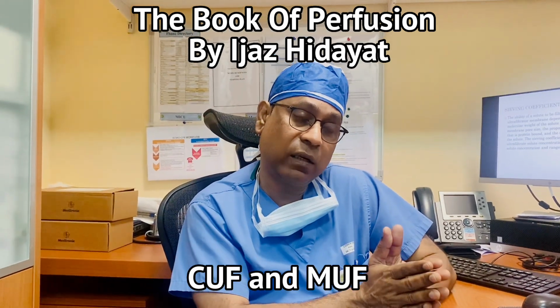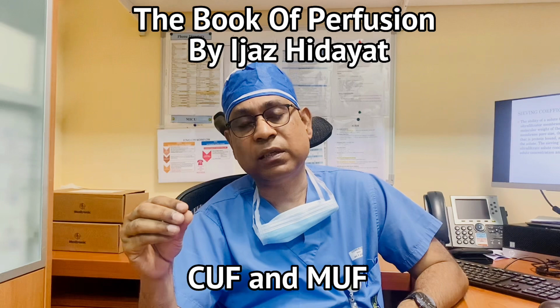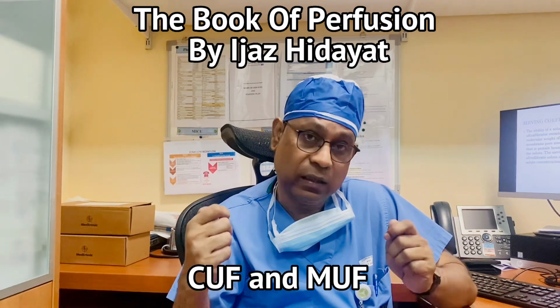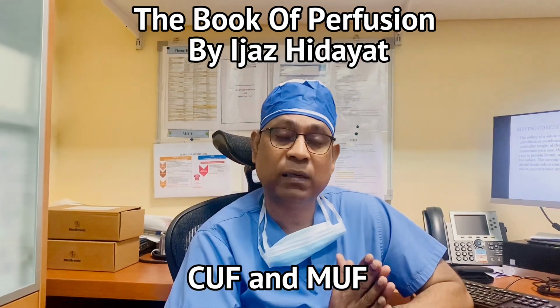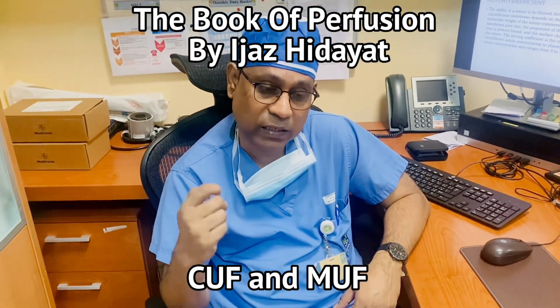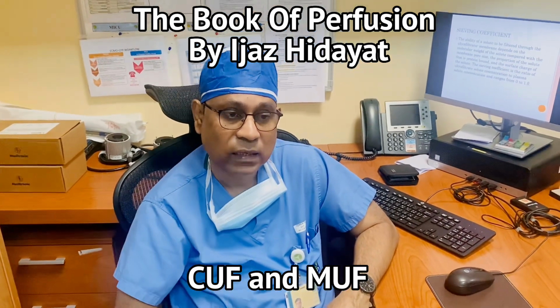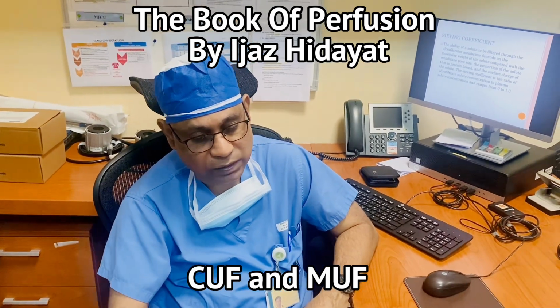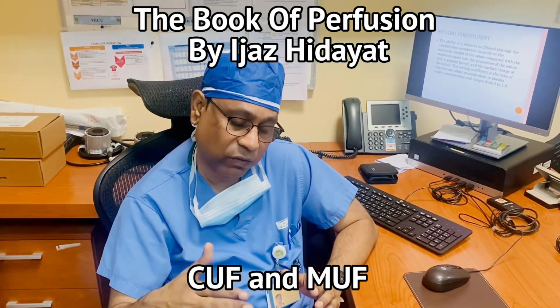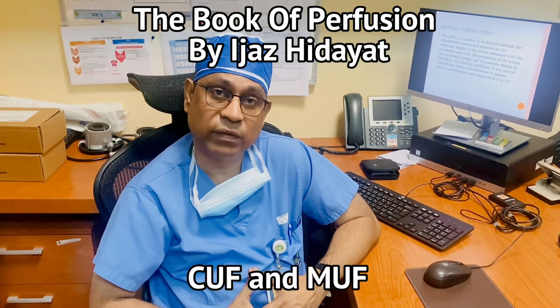So conventional ultrafiltration happens during the bypass, but modified ultrafiltration is immediately after bypass, when the cannula is still inside the patient, but we are weaned from the bypass. The circuit design for modified ultrafiltration is that we take oxygenated blood from the arterial cannula, the arterial side, and the blood passes through the hemoconcentrator at a low rate. After passing through the hemoconcentrator, we return the blood into the right atrium with the venous cannula.